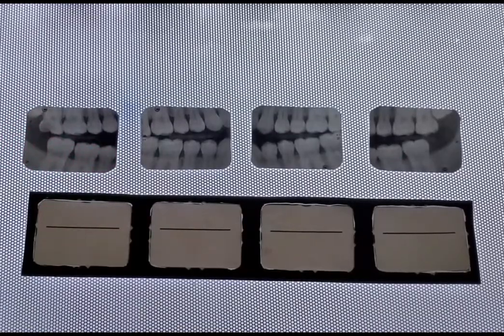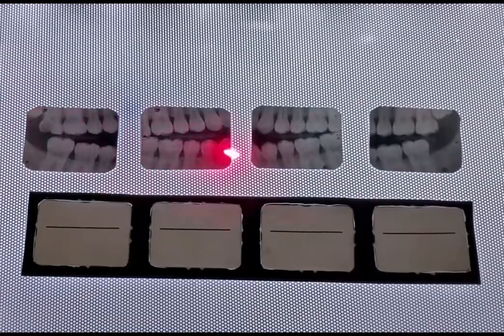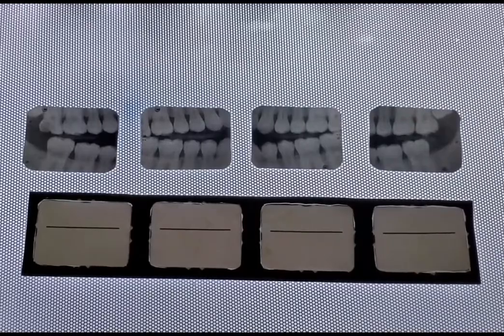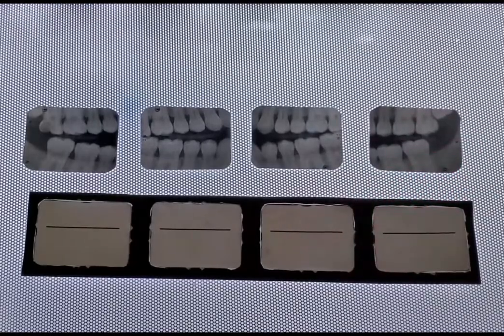Bite-wing radiograph images should be oriented so that the occlusal plane presents as a slight upward curve or smile. Roots of most teeth curve distally. We identify the anatomical landmarks to assist distinguishing radiographs such as the curve of Spee.